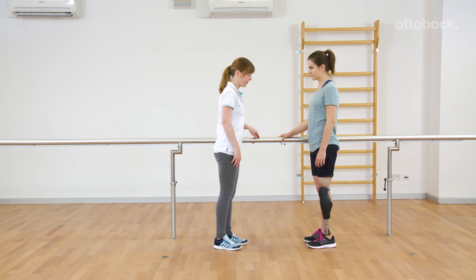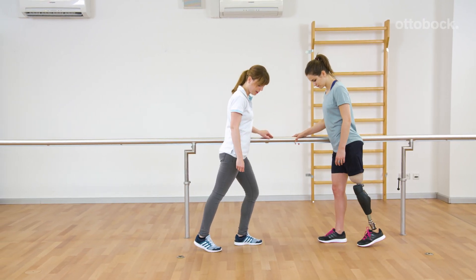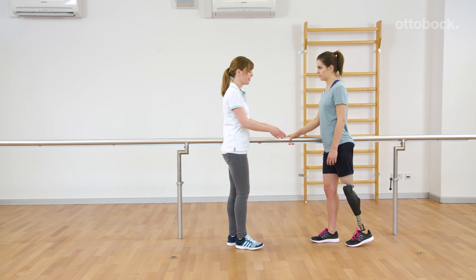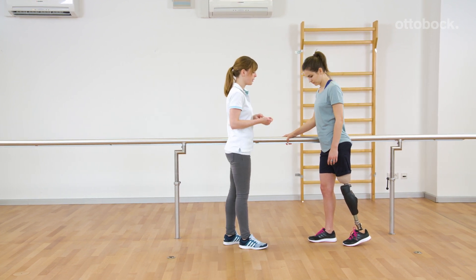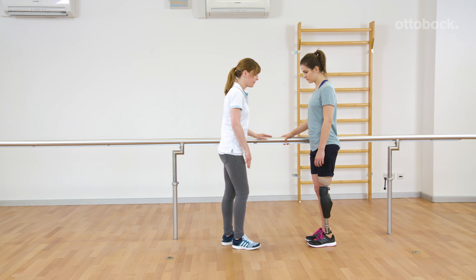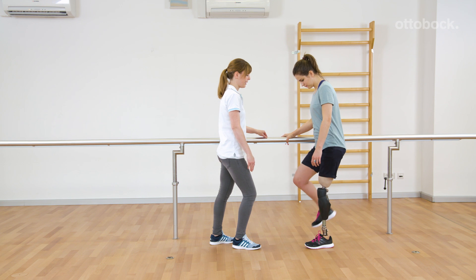Franziska shows how to switch between the first and the second my mode by motion pattern. For the first my mode, this means bouncing three times on the forefoot within one second, and then unloading the prosthesis. After one long beep, two following shorter beeps confirm the switching into the first my mode.